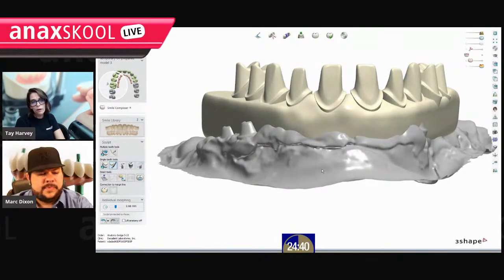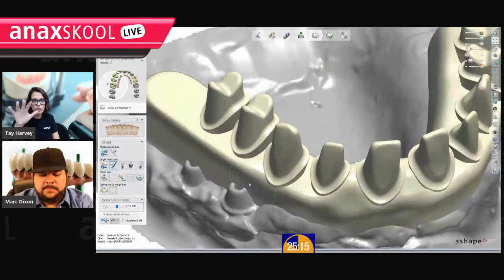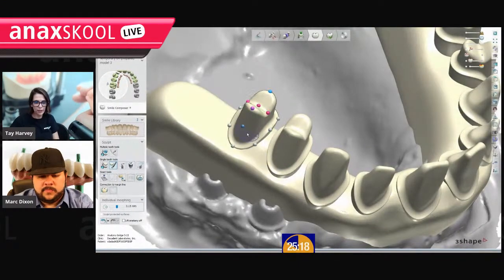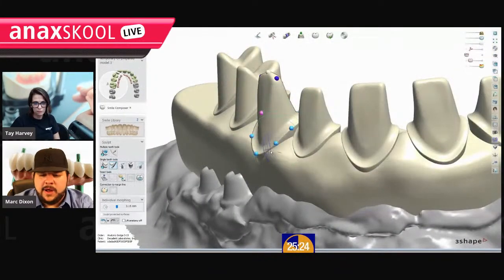So I had a question from somebody who couldn't watch live today. They weren't able in 3shape to get the contours at this stage where they wanted them on the margins. So they were milling it in the Pecton, then taking a handpiece and carving it the way they wanted, finishing it with a handpiece and then double scanning. So do you ever do that? Or is it possible to get the contours and the margins just how you want them using this easy abutment library? So you can do whatever you want and get them however you want them.